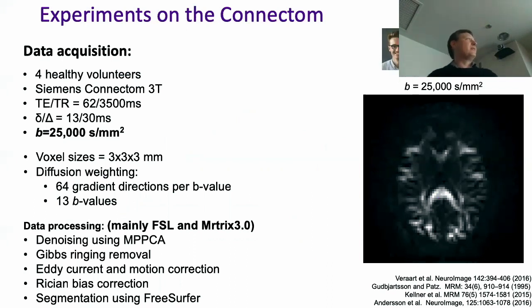So Yella Gerard, our postdoc, went to Derek Jones's site, sorry, and asked them, how about we go up to say b = 25,000. And they would say, oh, you won't see any signal. And Yella is like, no, there is a theory according to which you will have a signal. They said, no, we never went beyond b = 7,000. So just because, well, you know, this is b = 25,000, or 25 in physics units, microns and milliseconds. There's a lot of signal, as you guys know.